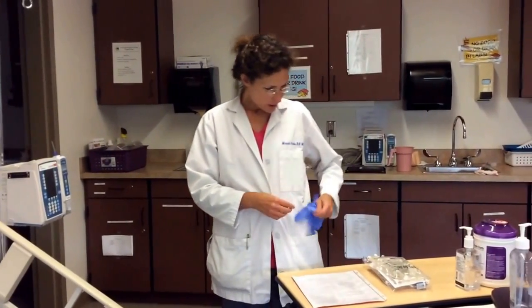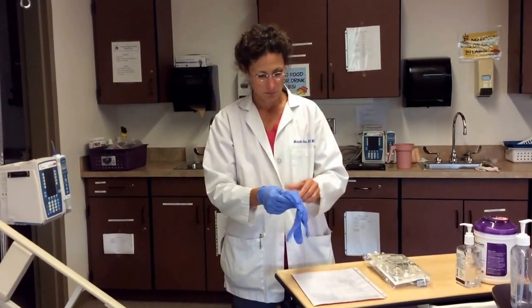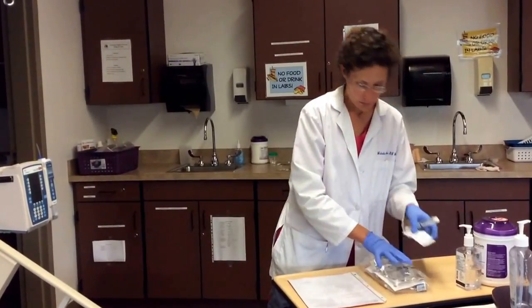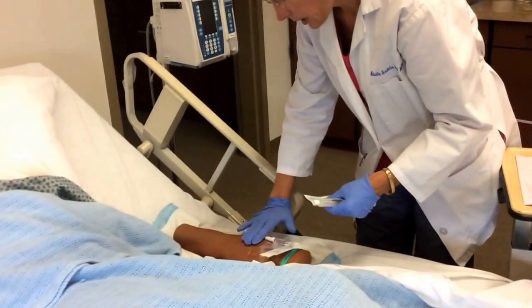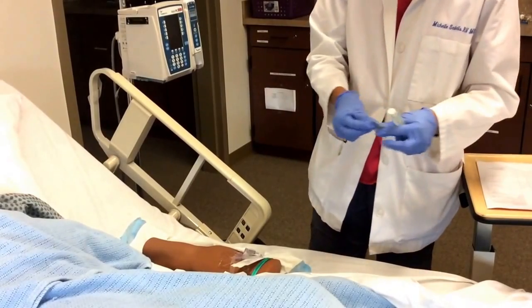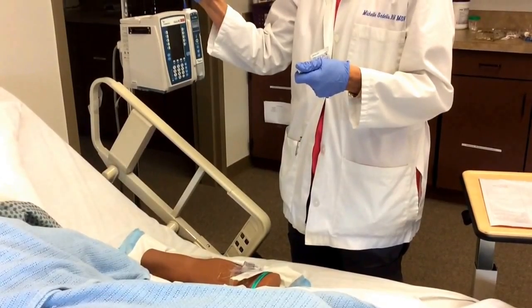All right, so at this point, I'm going to put on some gloves and assess this IV site. Okay, so I see there's no redness or swelling. He denies tenderness at his IV site. I'm just going to flush with a little saline to make sure that this site is patent.